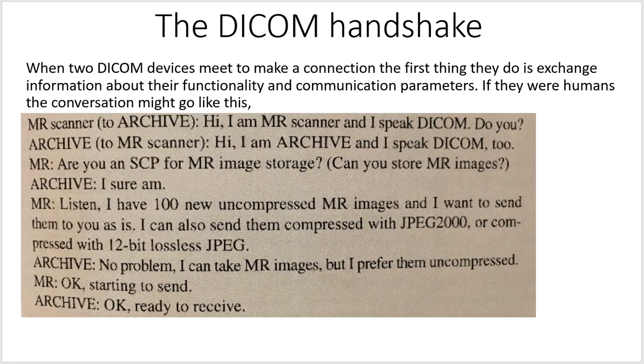When you click on a link in a web browser, it's only doing TCP/IP, and it just takes you to that server or that location and it opens up right there. Here in DICOM, we're transferring the images from one place to another, and you have this really chatty conversation going on back and forth, and that just makes the whole transfer process slow.